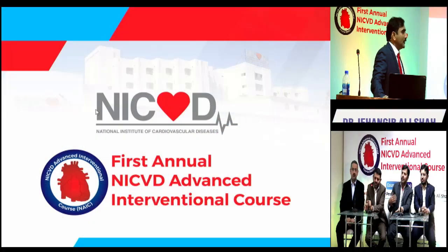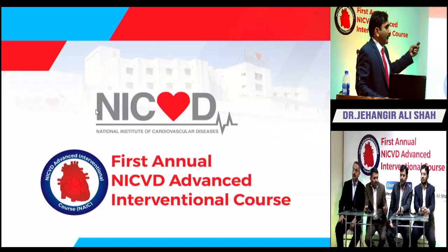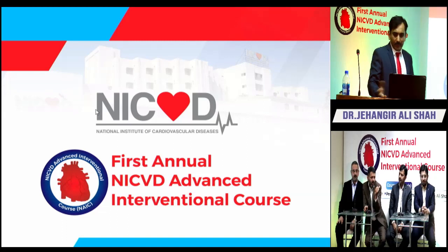That's not a scenario where there's a CTO. At that time the patient is in cardiogenic shock, and I think we need the IABP in that case, but not here, because this is an elective case.